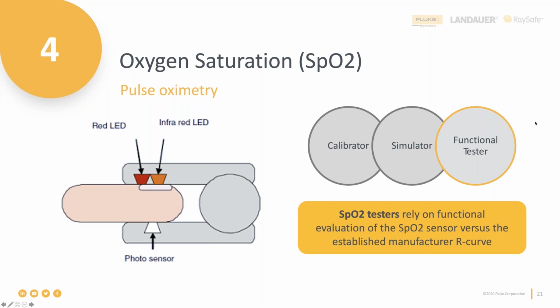through the finger. So the actual SpO2 functional tester is pretty complex and does a lot in a very short period of time. It can adjust for oxygenation level, skin color, finger thickness, and even the type of ambient lighting in the room. And all of this adjusts to make sure that you're getting the right readings so that whatever patient the pulse oximeter is ultimately hooked up to, you get the right reading. And there was actually a recent FDA communication on the effect of these changes on SpO2 readings, which we'll share in the chat. So Dan, if you could post that, that'd be great.